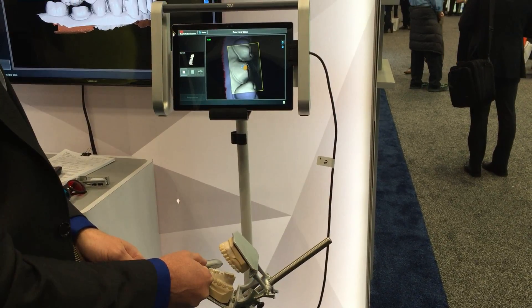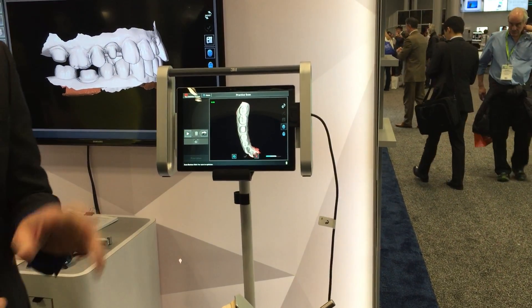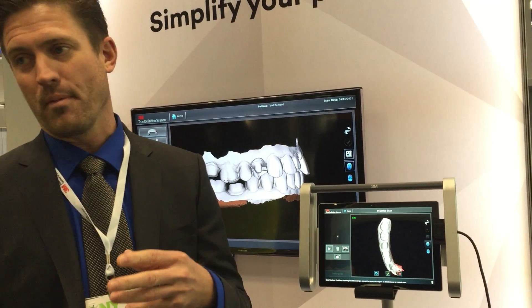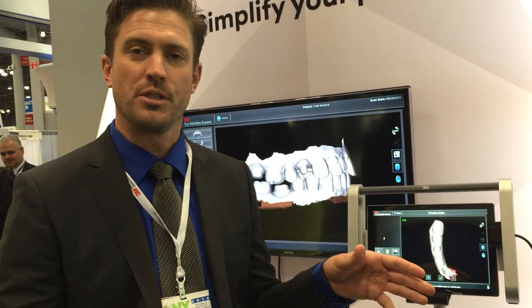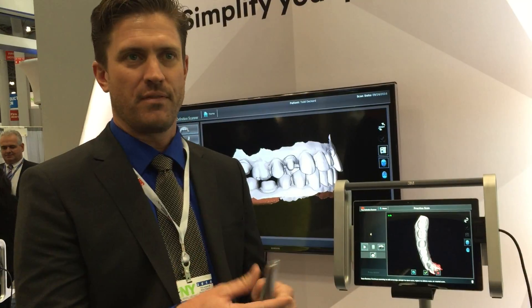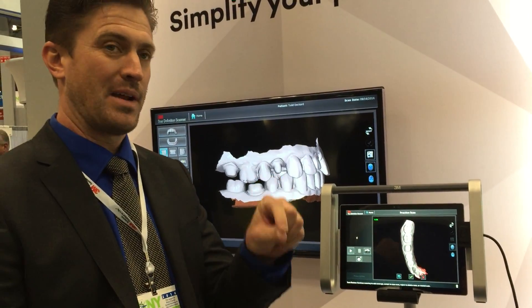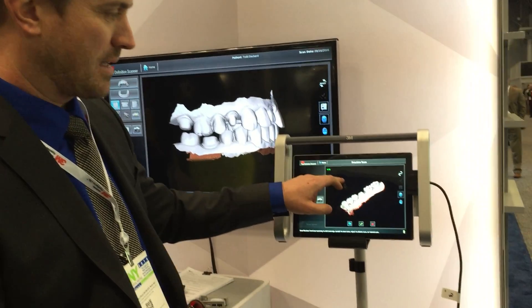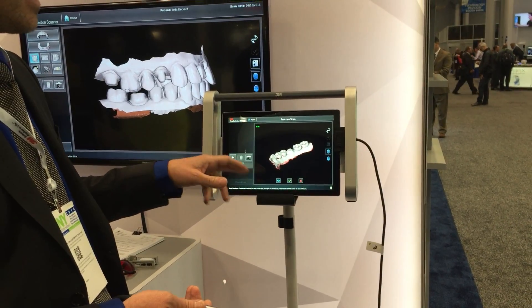Dentists tend to be very detail oriented so they're going to want to get every little piece. One of the really nice things about the scanner is it shows you what you don't have. For dentists that could be a problem because they want to get every little piece, but the nice thing that really makes this accurate is that the computer is not extrapolating to fill in data. There are three HD video cameras in here to pick up all the data. I want to see what I don't have to make sure I've got the most accurate scan possible. You can go back and get these little spots and it takes just two seconds.